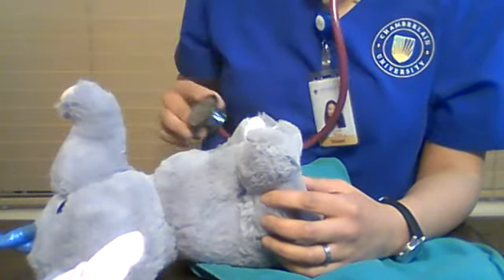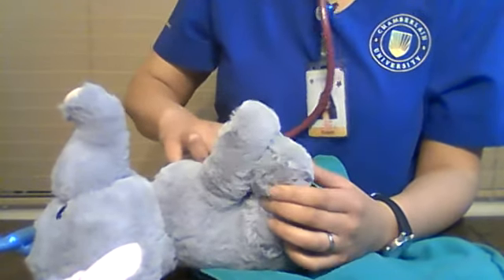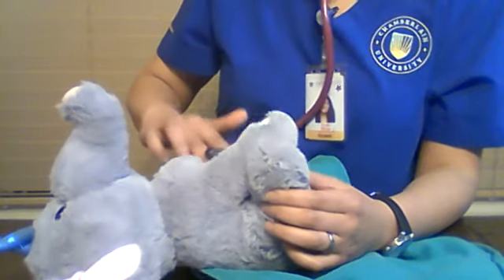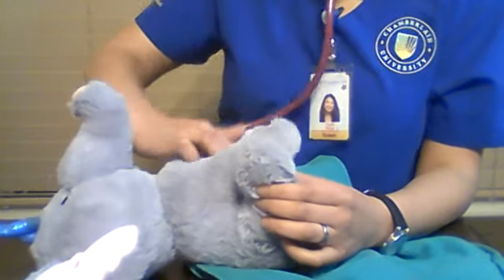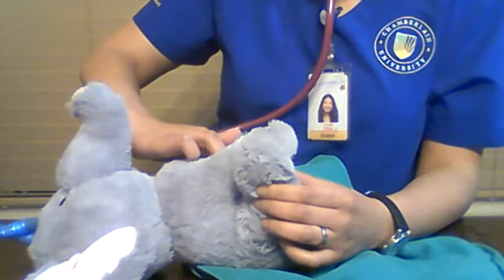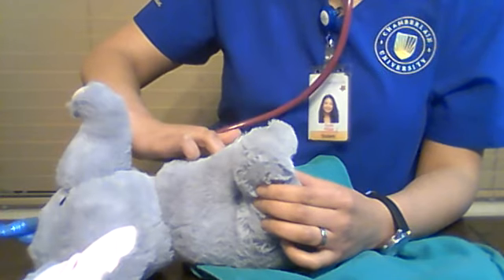I'm going to go ahead and listen to abdominal sounds. So I'll start in the right lower quadrant, right upper, left upper, and left lower. Within 15 minutes of birth, there should be bowel sounds present. So we are good there.